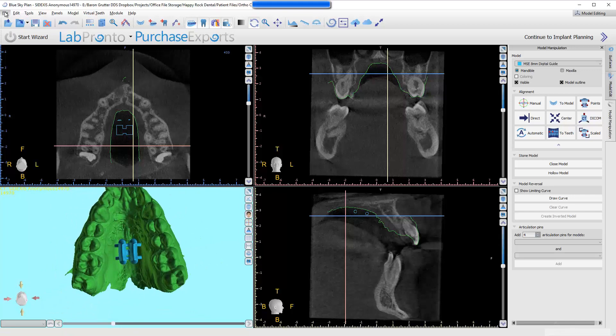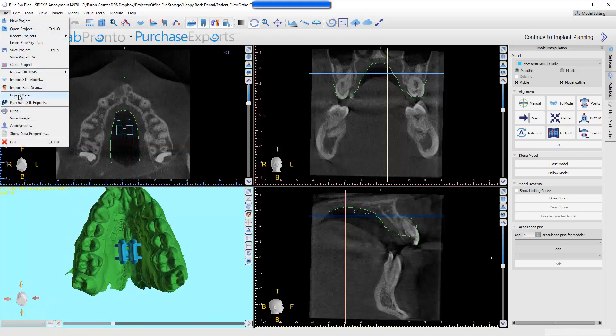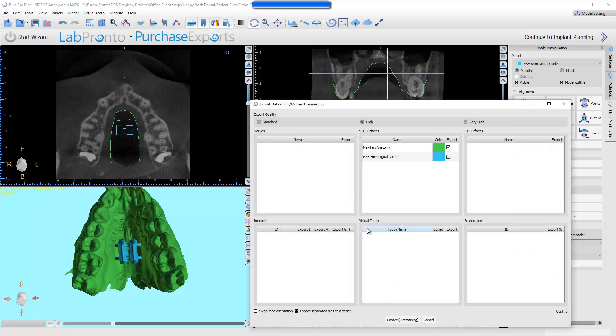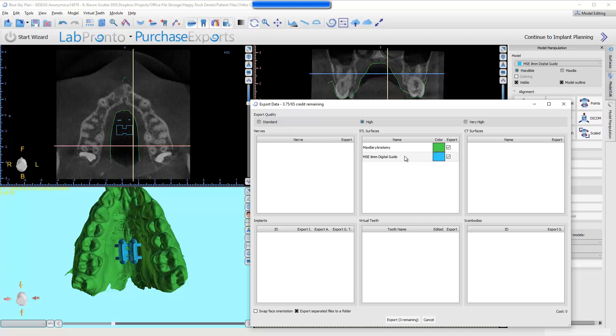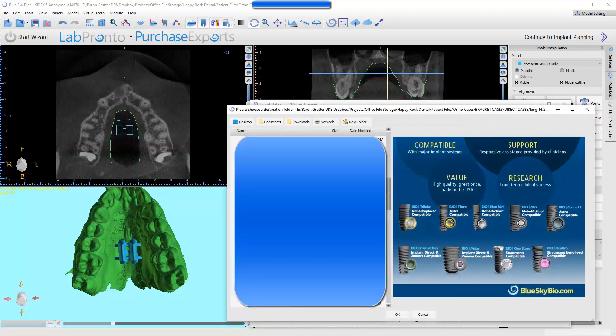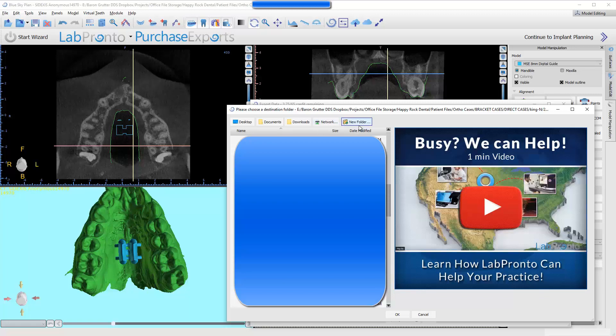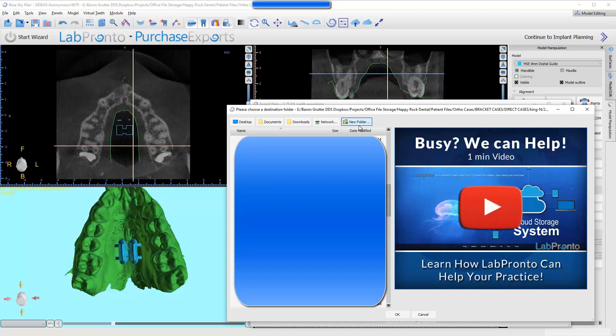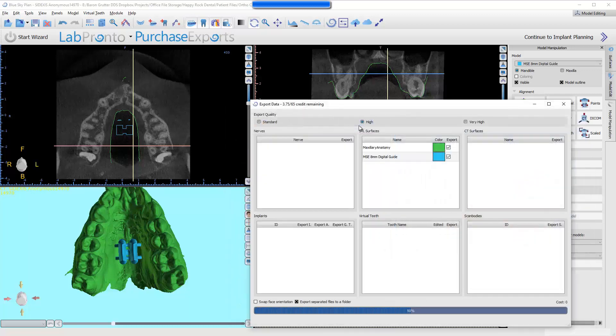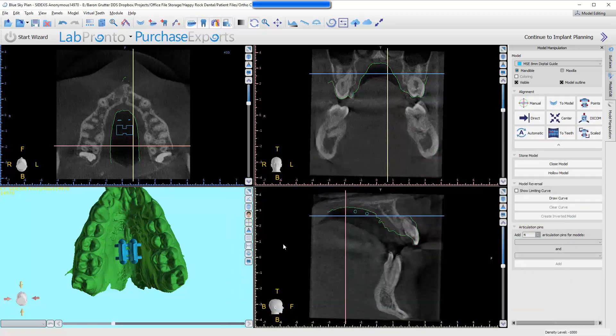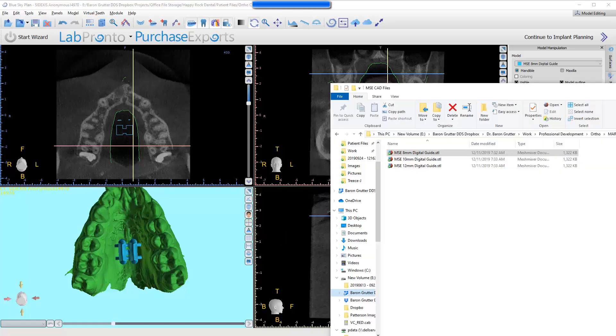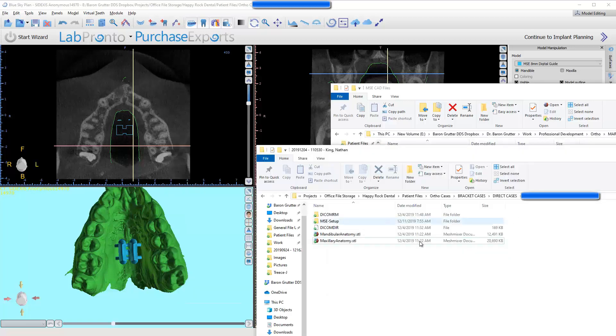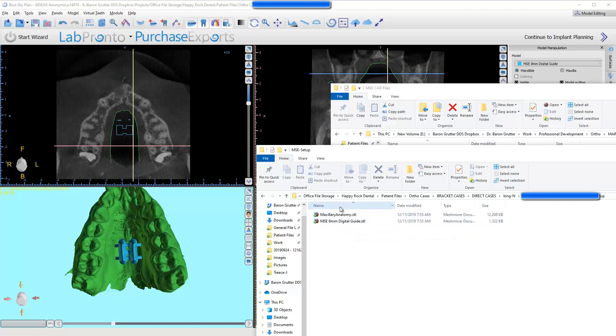I'm going to come up here to the file, export data. You do need to own exports for this function. It's not going to charge you anything, because we haven't created anything. We just moved files around. But, you still have to have exports. So, buy five, or if it's your first installation, it should come with two. We're only going to export these two objects. Hit export. Create a new folder. MSE setup. So, here's this folder that's got these two things in here, the arch and the appliance.